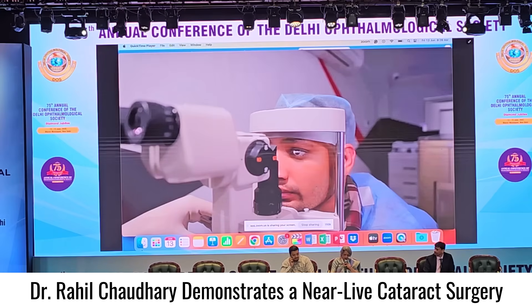Question: How many of these lenses have you implanted in practice so far? About 45 now.